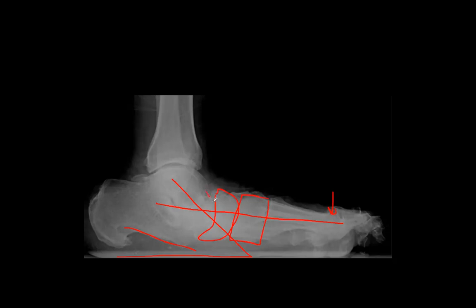But then when you look at the talar head down here, and we bisect that, we know that we have the lines from the talus plantar to the area of the bisection of the navicular here. So we would say that this is a TN sag, a TN fault, a TN break, etc.